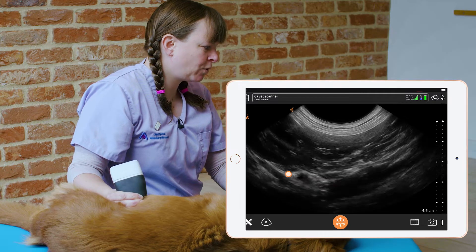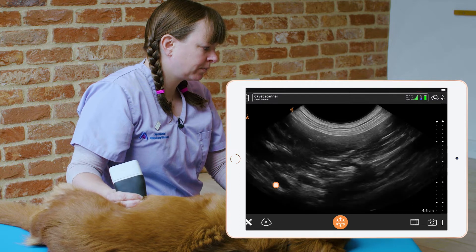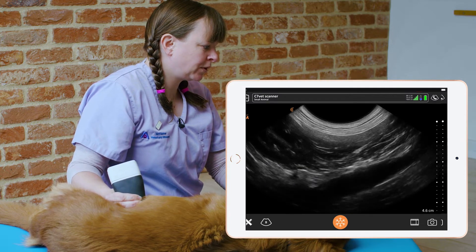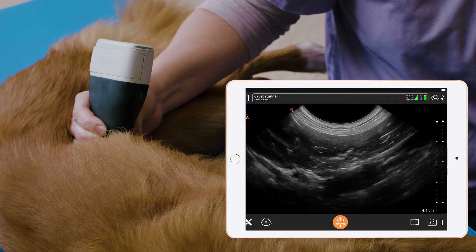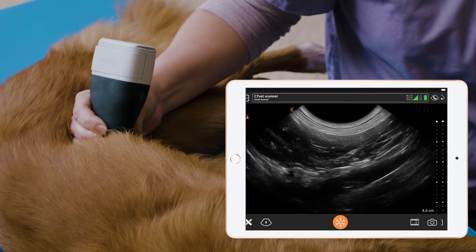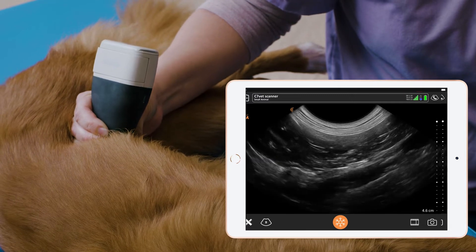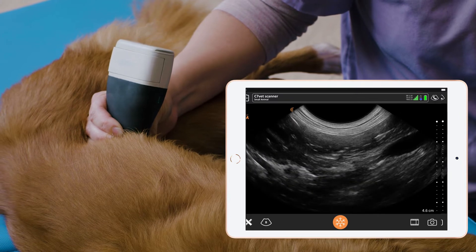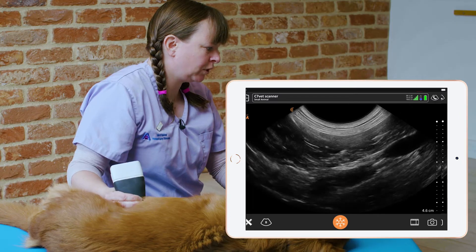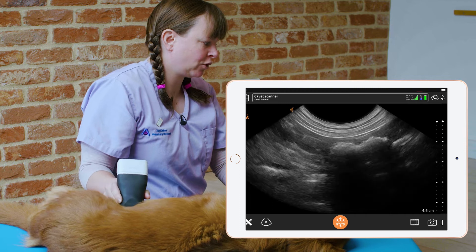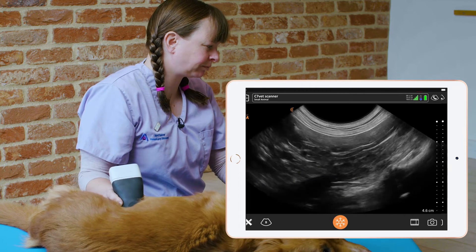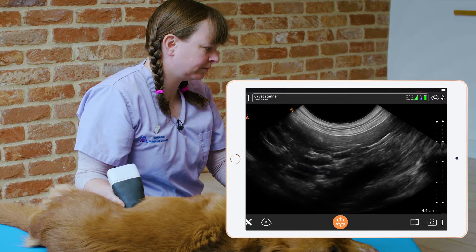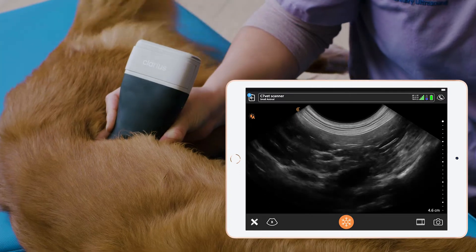So once we've got those landmarks, we want to just focus in and add a bit of pressure with the probe to try and locate that left adrenal gland. We're looking for a peanut-shaped structure in that area, and there we have it.